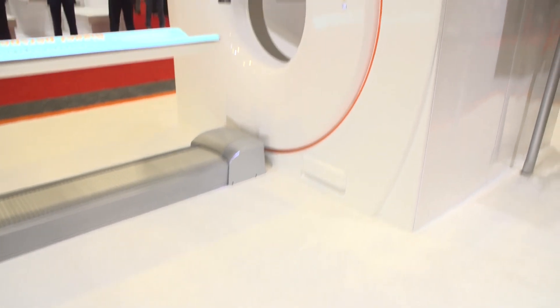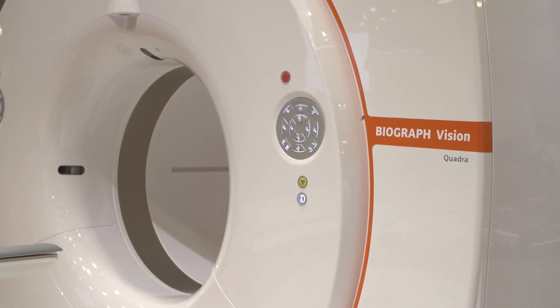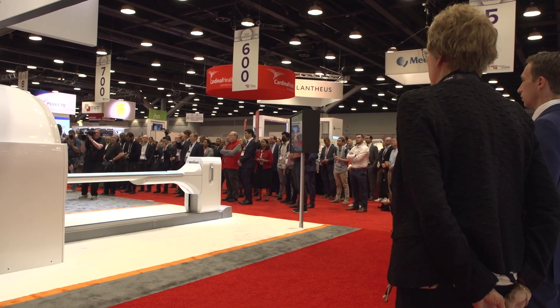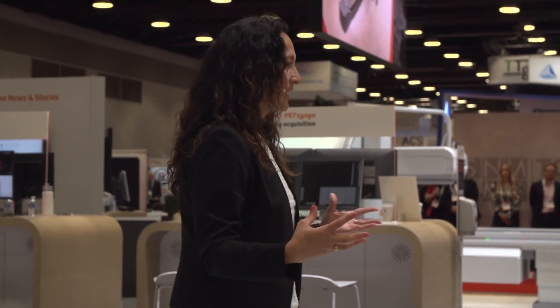The Biograph Vision Quadra can address the challenges for customers who want to do research in a routine manner. It enables efficient and effective clinical workflows and throughput, so you can delegate time to researchers during normal working hours. Additionally, the scanner fits in a traditional PET-CT scan room, making it a very practical scanner for both clinical and research use — moving PET forward.